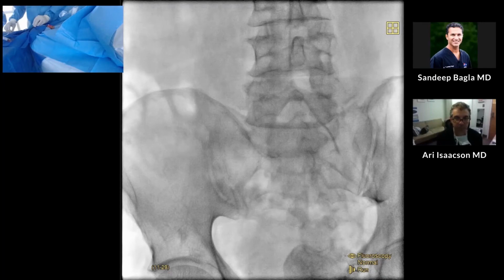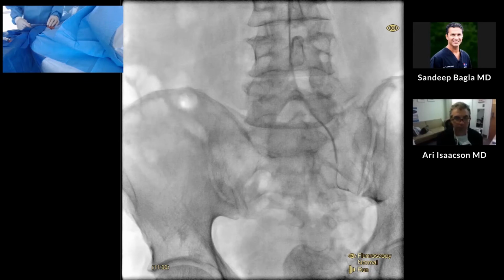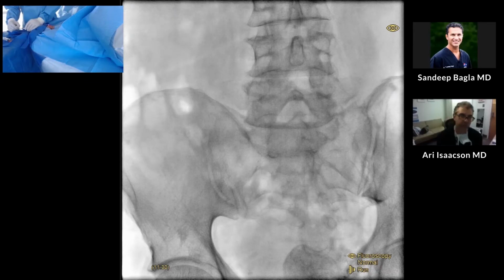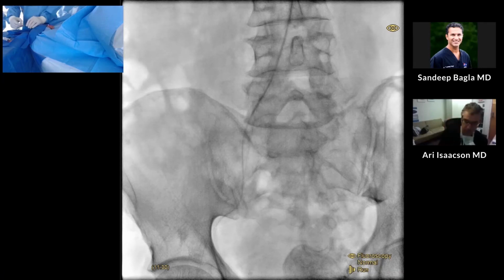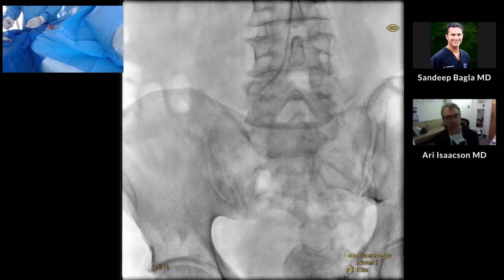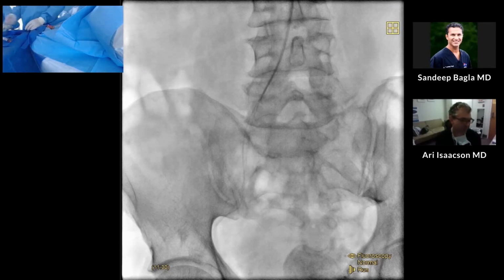What is it for you these days with PA? I know obviously you have a busier PA practice than most, so this may be fairly atypical. When you speak to other folks, what are you seeing is really the dominant types of cases people are doing? Large glands like this, or what are the typical kinds of cases people are getting? Are they getting surgical failures or contraindications? What are you seeing is the most common type of case? Yeah, I think in general I would say larger glands, maybe larger glands who are also anticoagulated. And then a lot of them are really difficult patients with a lot of comorbidities that urologists didn't want to put under general or spinal anesthesia.